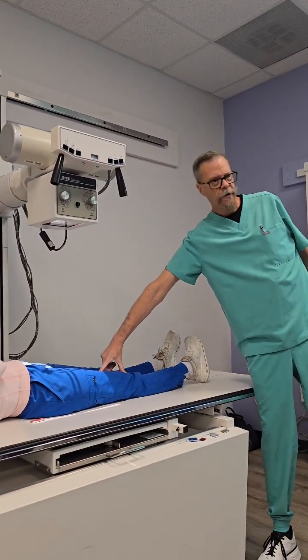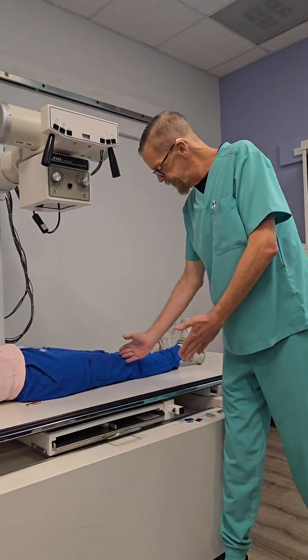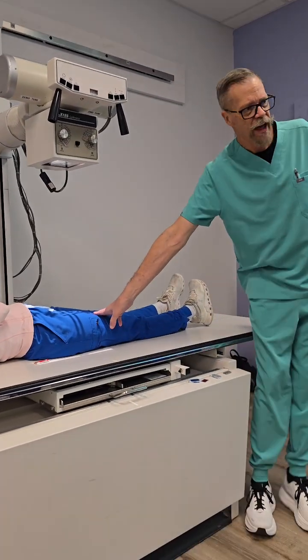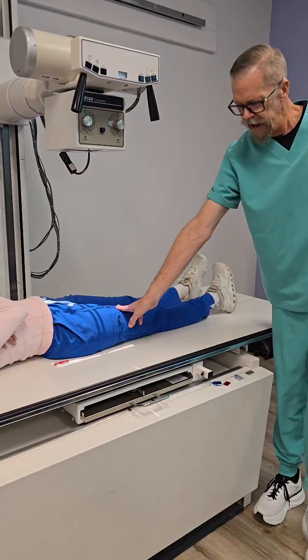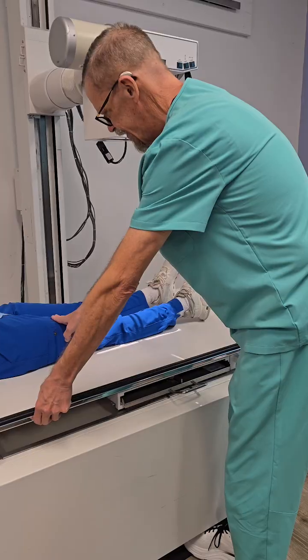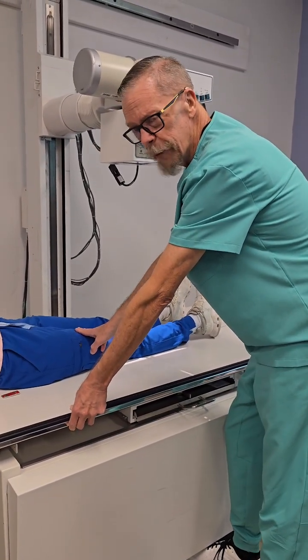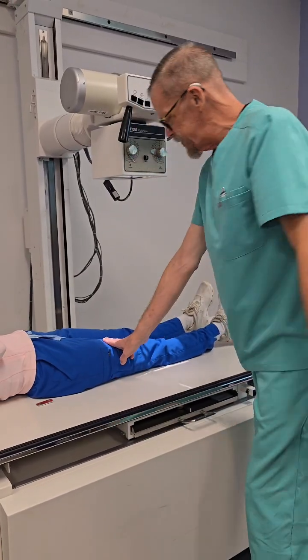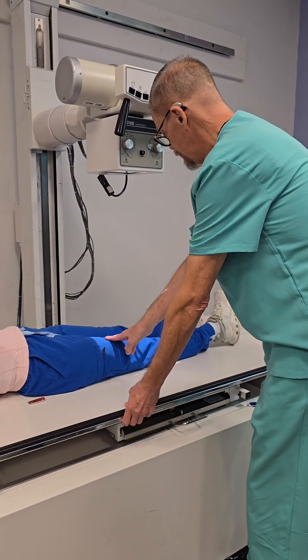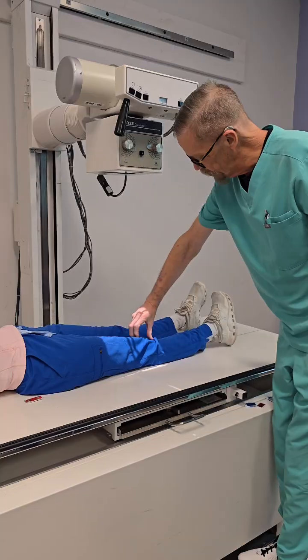All I have left is from here to here. What I do is I put three fingers right here in the light. When I move it, as long as my fingers don't go out of the light we're okay. So as long as my light overlaps where my fingers were, we're okay. I can even collimate a little bit from that 17 inches because we don't need that much.